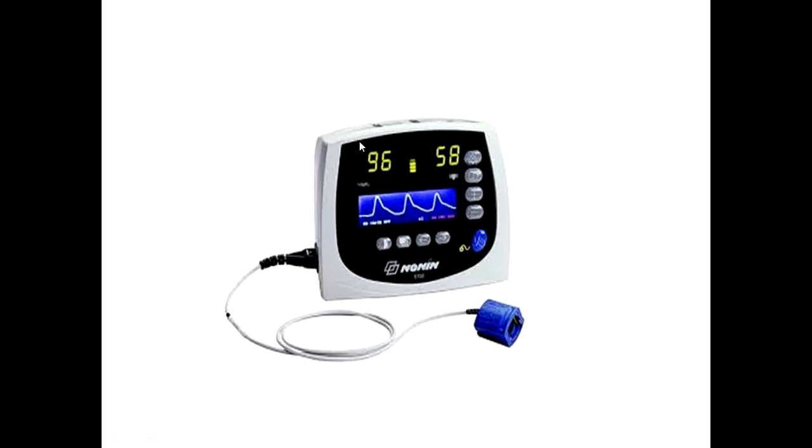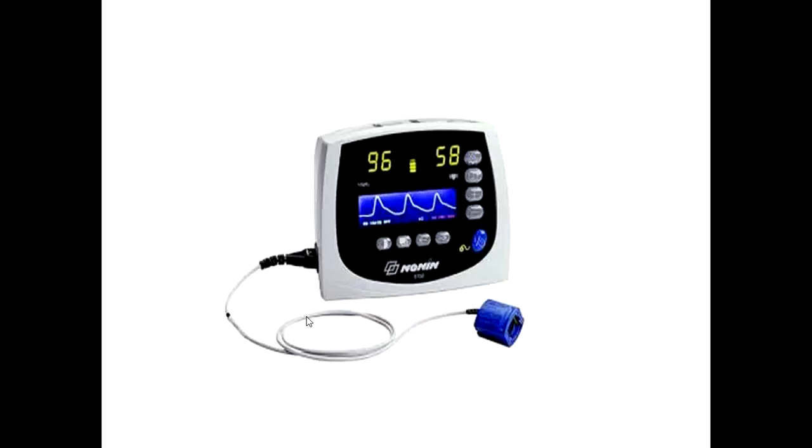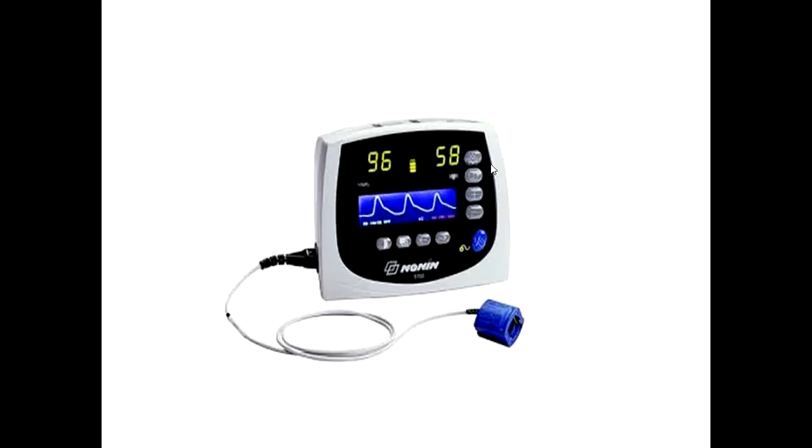This is the pulse oximeter showing saturation 96%, heart rate 58. So instrument pulse oximeter, two parameters I have told you. What are expected normal value in 1 year old infant? So normal value around 90 to 95% should be saturation in 1 year of age. Heart rate should be around 120 to 160 beats per minute.